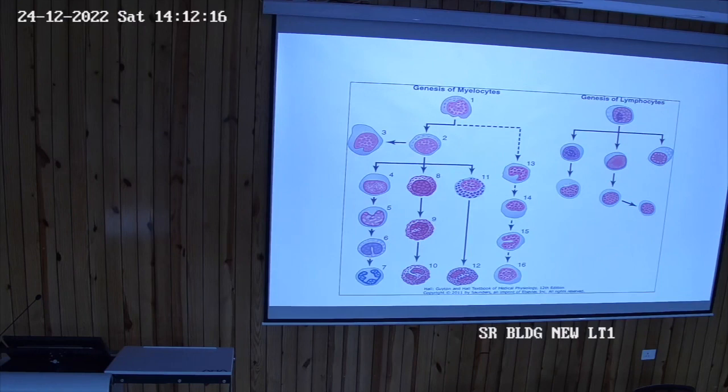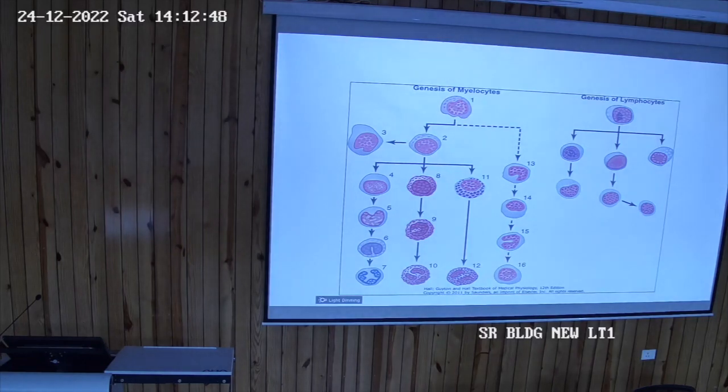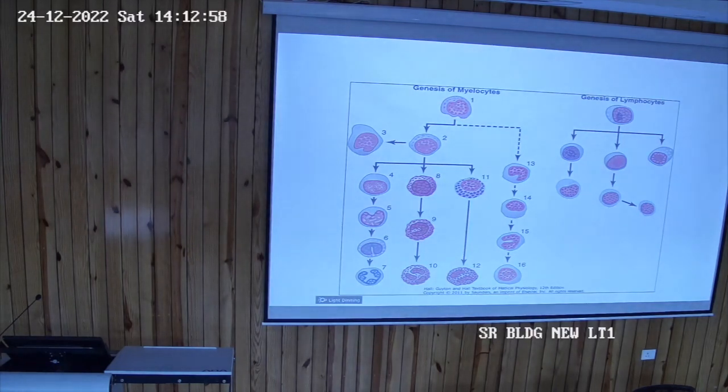Okay. Another last important cell is monocyte. It is one of the biggest cells, WBC का maximum size, but it is not 100% rule कि सबसे बड़ा सेल होगा. वो आपके स्लाइड के ऊपर डिपेंड करता है, मेच्योरेशन की किस स्टेज पे उसको आपने फोकस हुआ है. ठीक है, किस मेटाबॉलिक स्टेट में अपन ने उसको स्लाइड पे फिक्स किया है. Okay, so depending on all these conditions, but the prominent feature is the nucleus is 100% indented. It will not be a regular rounded nucleus, it will be an indented nucleus, maybe horseshoe shaped.